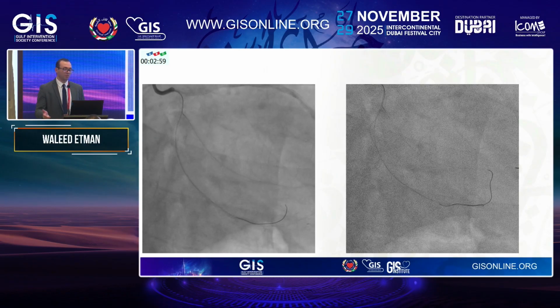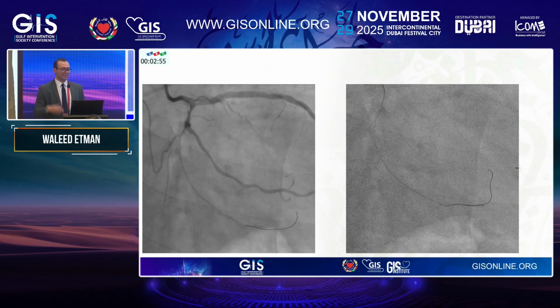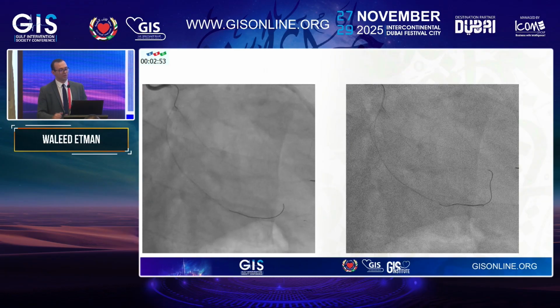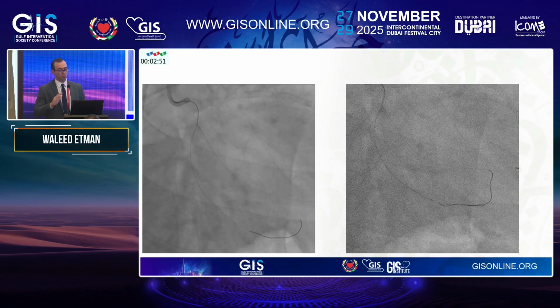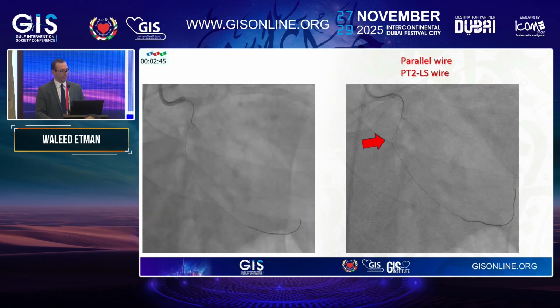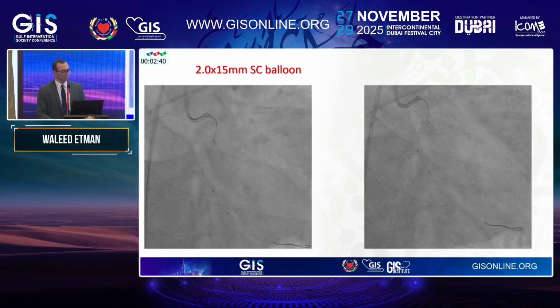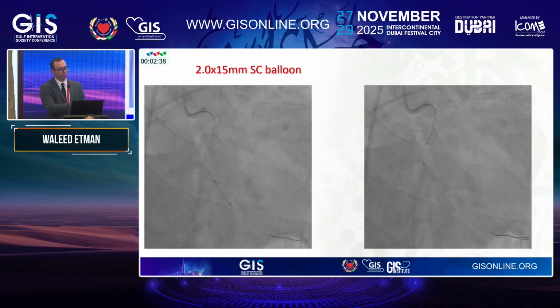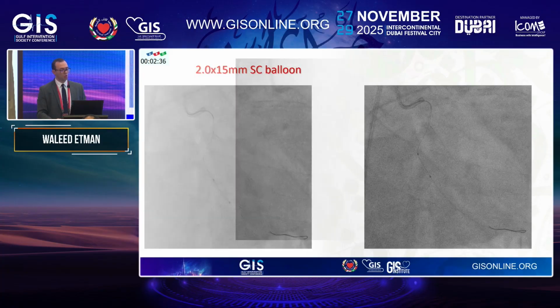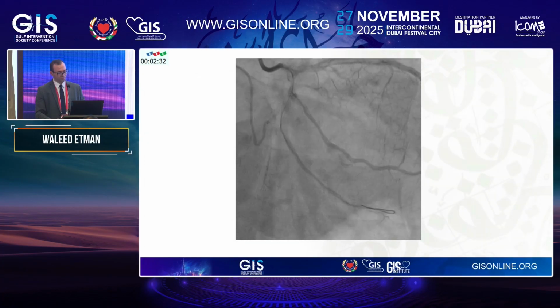As you can appreciate, the Pilot 150 took another turn. Maybe the Pilot 50 was in a dissection, and maybe the 150 did a dissection re-entry. I didn't have an IVUS to study why the wire took this bend. However, the semi-compliant balloon passed easily. Now, as you can appreciate, the semi-compliant balloon passed distal to the lesion. We pre-dilated well. Now we have restored the flow.